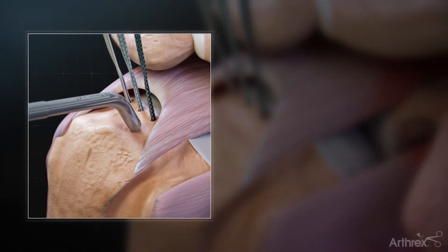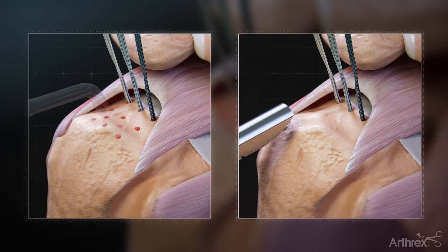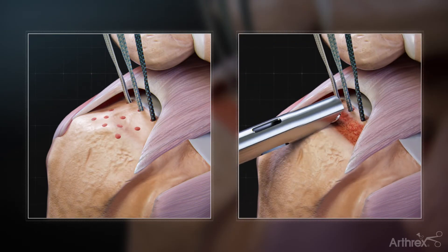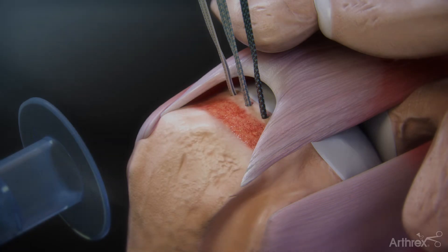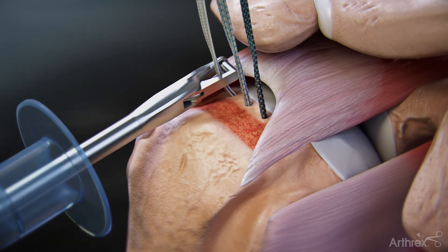Any bone preparation, such as a power pick or burr, should take place lateral to the anchor insertion site for the medial row. Using a FibreTape Retriever from the lateral portal, retrieve the FibreTape from the posterior anchor.